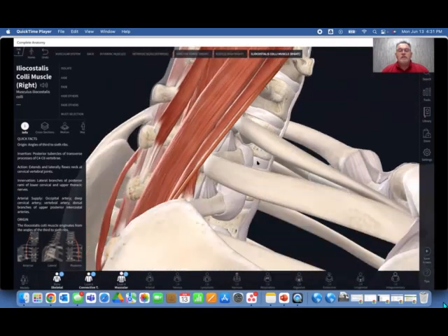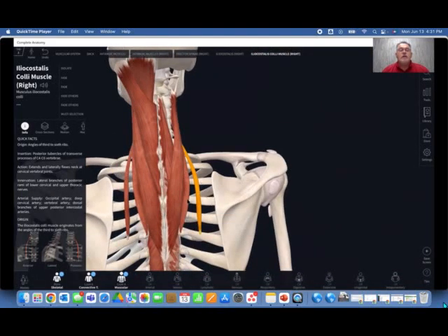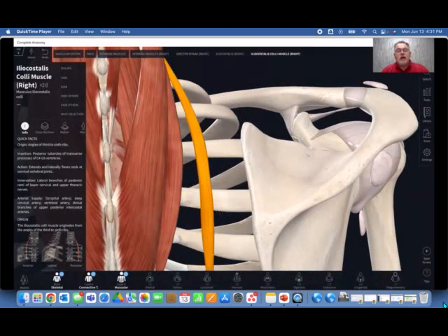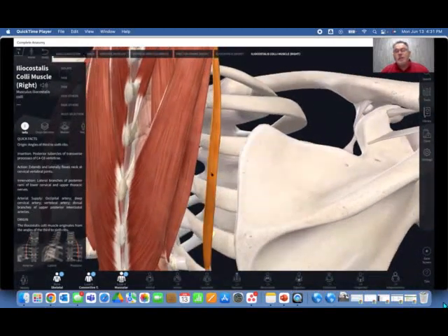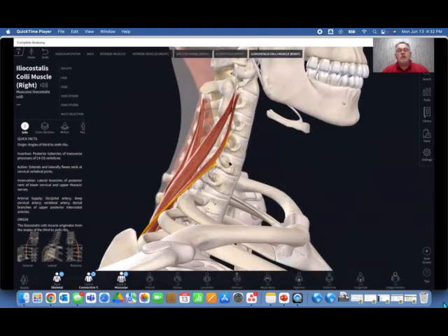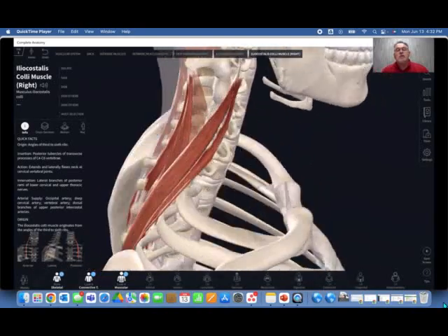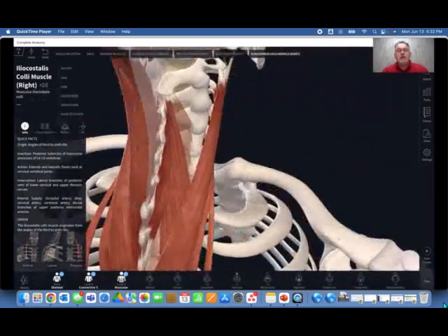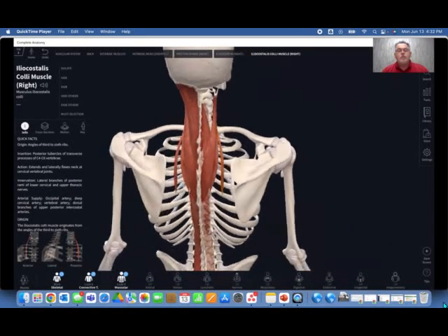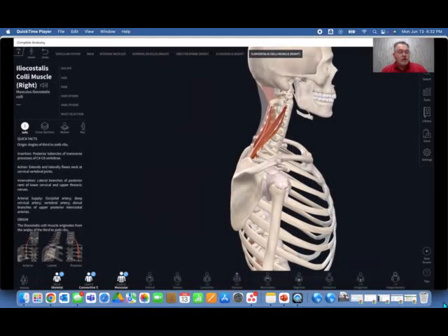So if we were to try to use dry needling for these small muscles on the thoracic rib cage, it would be rather challenging, and because of the location of the danger zones into the lung field, probably not recommended. But if we take an approach targeted towards the articular pillar on the lateral side, that makes it quite a bit easier to draw a needle to. And so we'll include that in a lateral approach, where we'll also include the posterior and the middle scalenes.